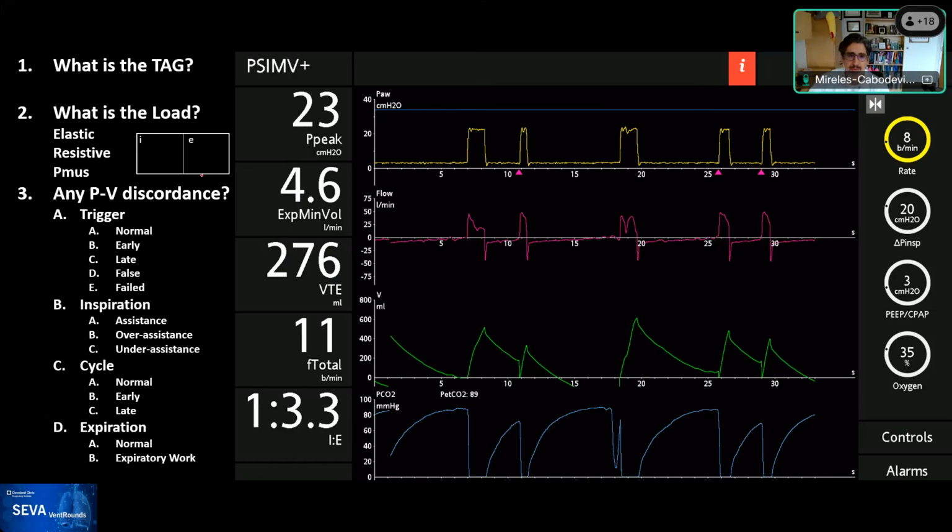And if you're unsure, you can put a partial answer, like, I'm sure that this is pressure control, or I'm sure that this is volume control. Excellent, I love it. So this is definitely pressure control. That's the first thing that we see. Great, Simran, also to see that.